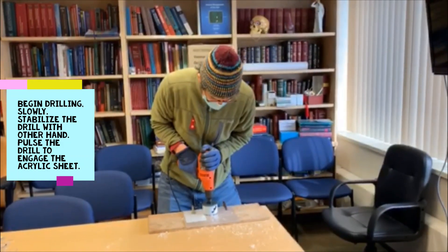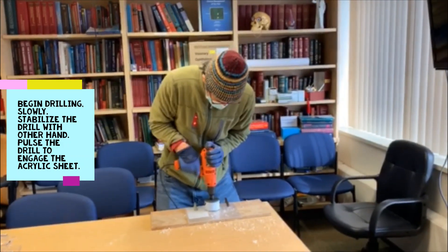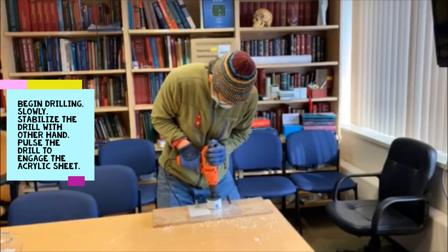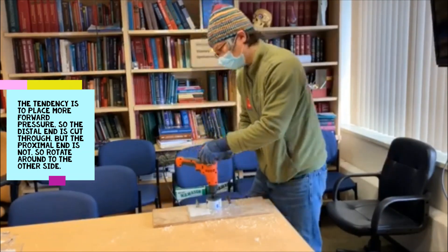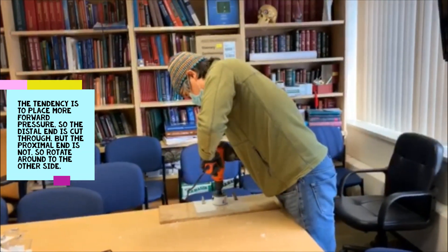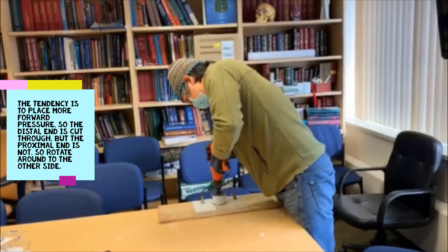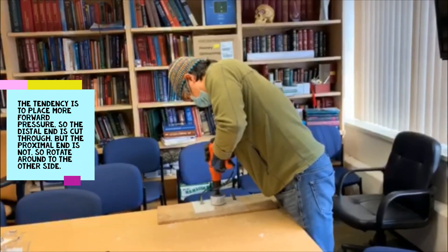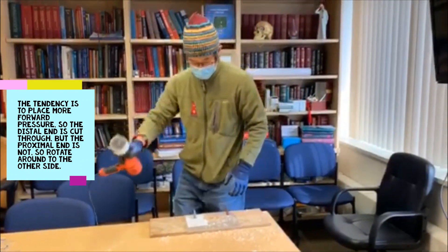I'm pulsing it because you don't want to go too quickly. The tendency is to lean forward, so I'm going to come around using my left hand and then finish the other side. Then I finally broke through here.